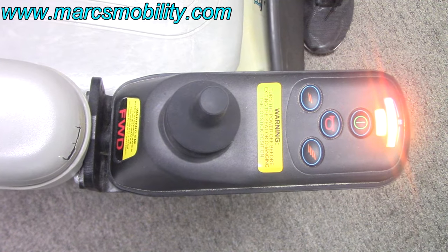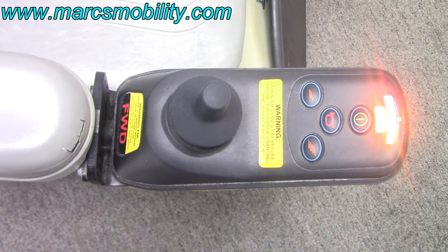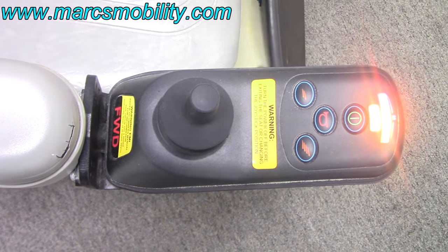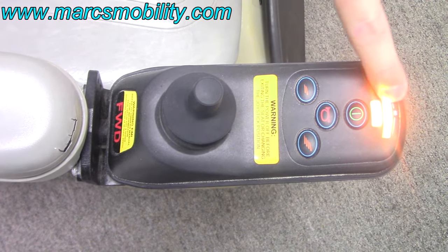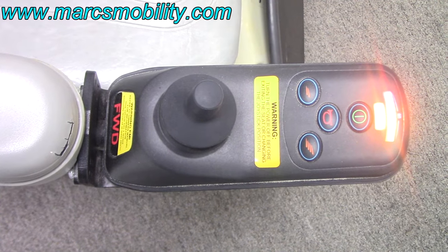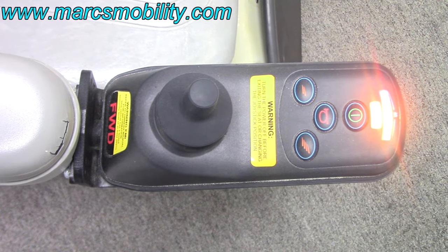This joystick has different fault codes, so we're going to show you what they mean. On a VSI, your fault codes are all based off the top bar of lights. You have three reds, four yellows, and three greens. However many total lights are flashing indicates what the fault code is.